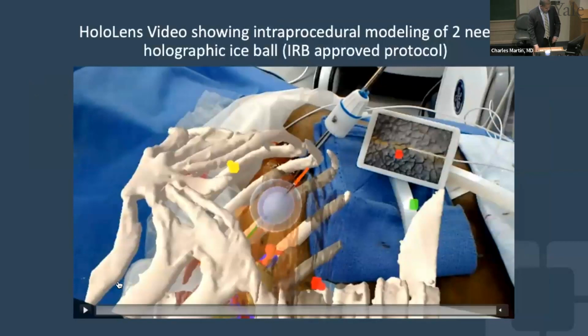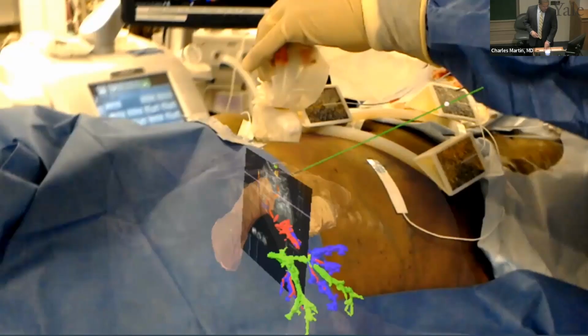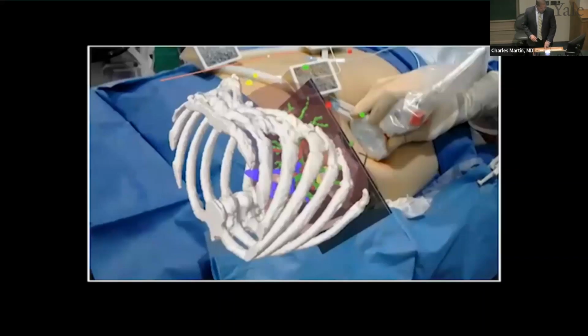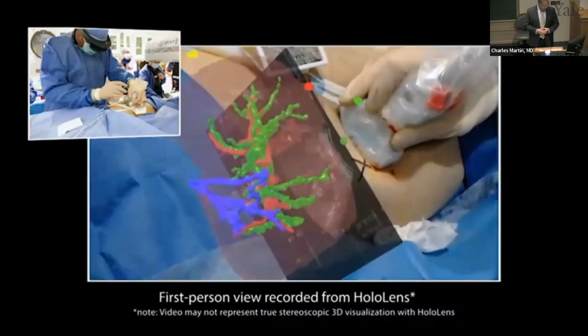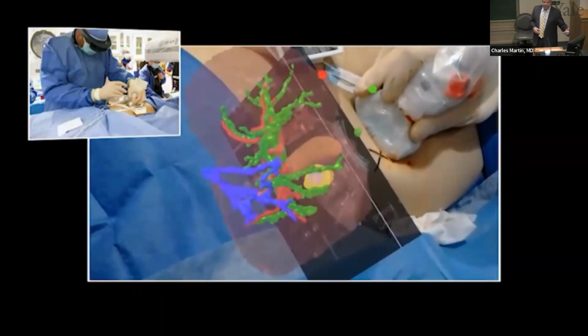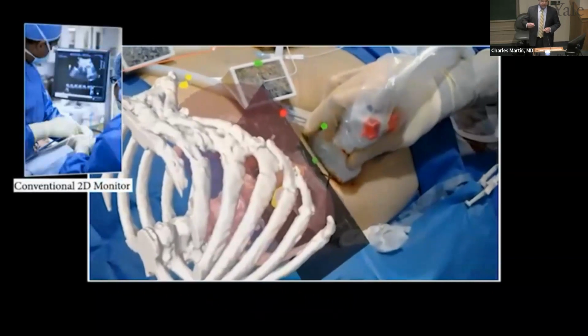This is that video again that shows the entirety of the process. But what this leads us to is the next portion, which is our teleprocedure and telecollaboration. So I wanted to show this one more time, demonstrating all of our work here. As we toggle this anatomy off and on, it's all using voice prompts. The way we typically set it up, we say tumor, bone, vasculature, and it all toggles back and forth. It makes it easier because you're able to use your hands the way you're hoping to use them.